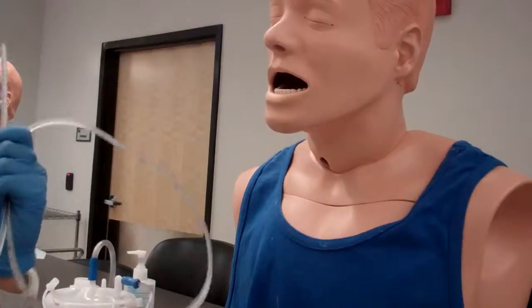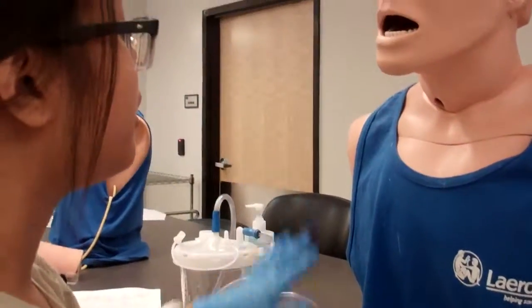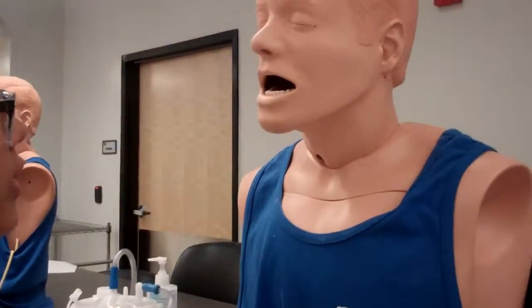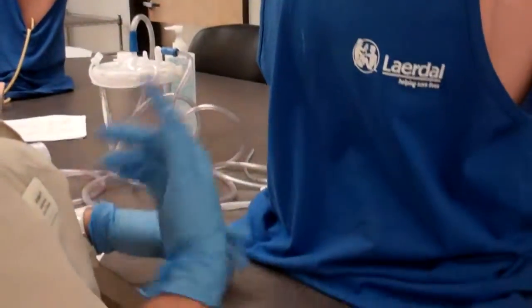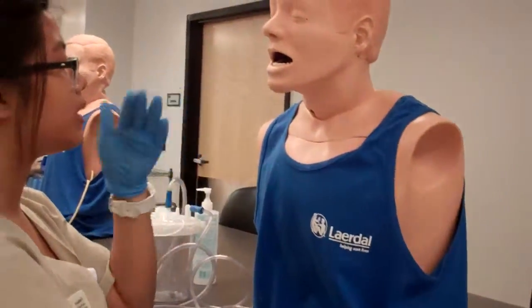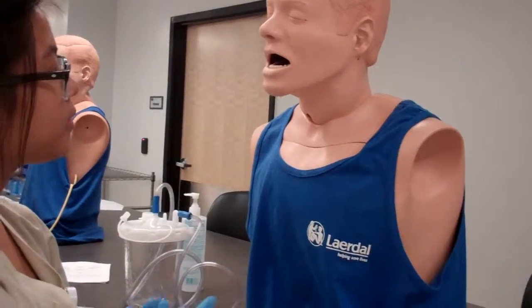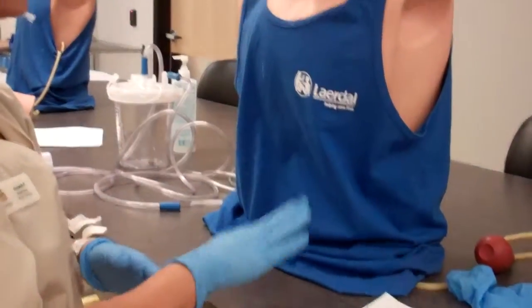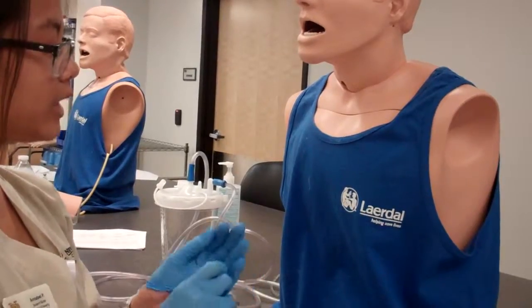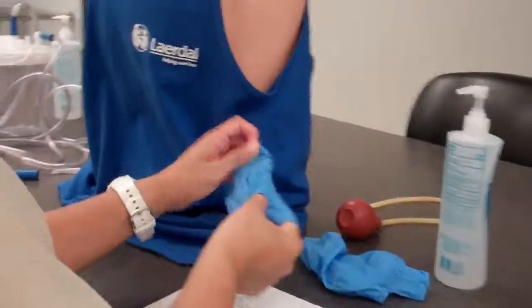Okay, good job. So now I'm going to go and discard my NG tube in the trash. How are you feeling, Mr. Schumer? Good? Okay, so here's mouthwash for your oral hygiene, and then here are also tissues to help wipe any secretions that came out. So is there anything else you need from me? No? Okay, so if you do need anything else, here's your call light, and make sure you use it if you need me, okay? Go ahead and document my findings, alright?